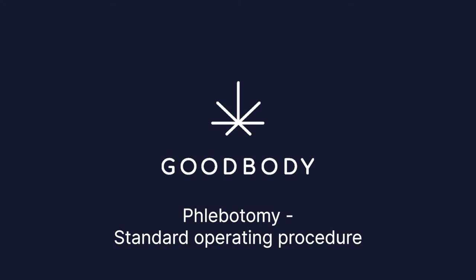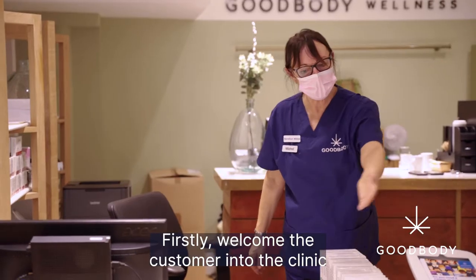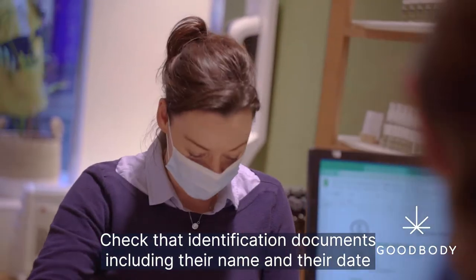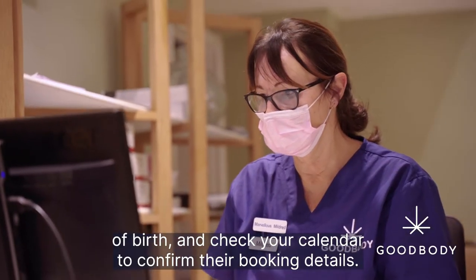This is the standard operating procedure for phlebotomy appointments with Goodbody Clinic. Firstly, welcome the customer into the clinic and take them to a private consultation area. Check their identification documents, including their name and their date of birth, and check your calendar to confirm their booking details.